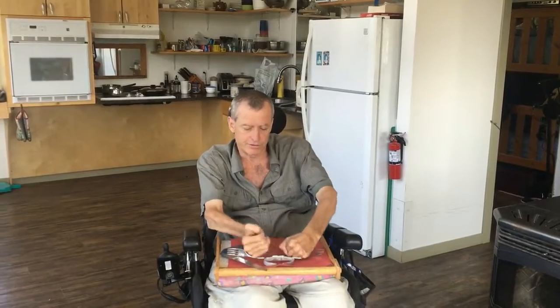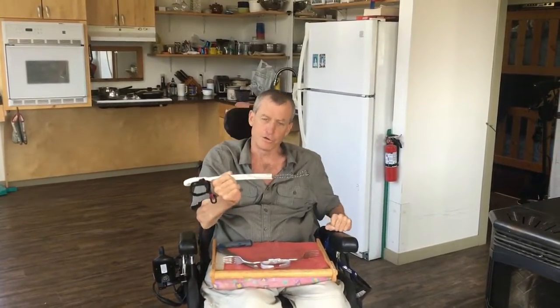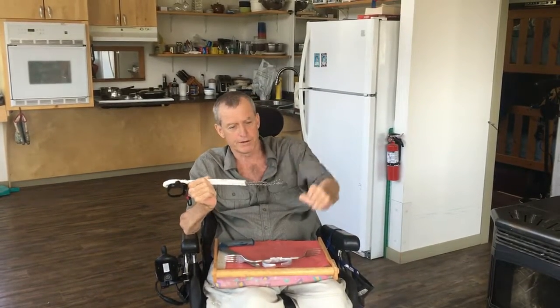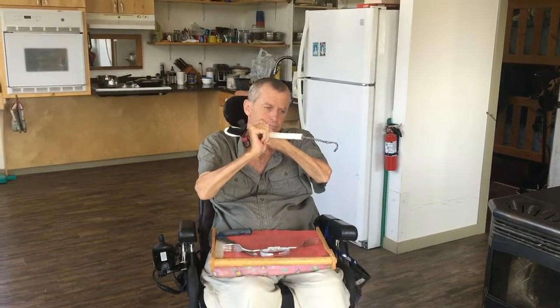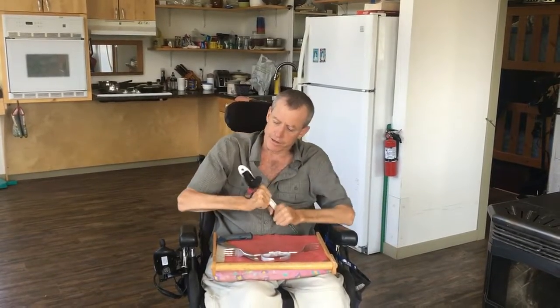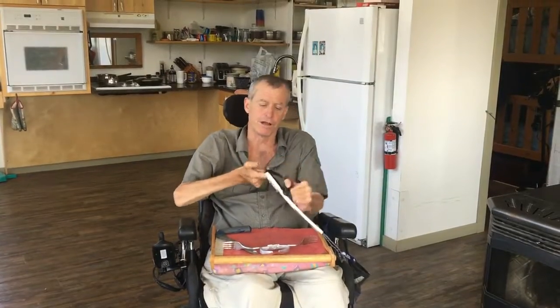Okay, that's the kitchen utensils. Now I've got a bunch of pickup sticks that I can show you. First one here, this is actually a toilet bowl cleaner. It was brand new, not used. It used to have a hoop around it with a bunch of bristles on it. So I crushed the wire ring down, and then I bent it 90 degrees or 180 and put a hook on it. And on the other end, it has one of these universal Velcro cuffs.